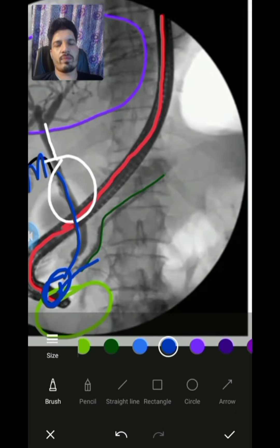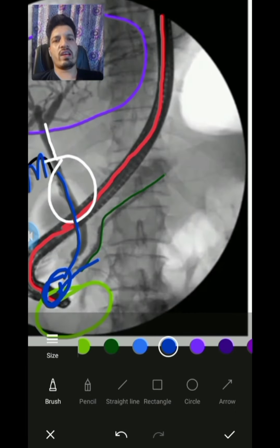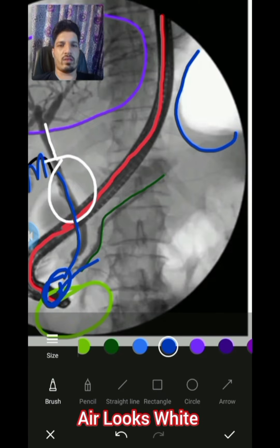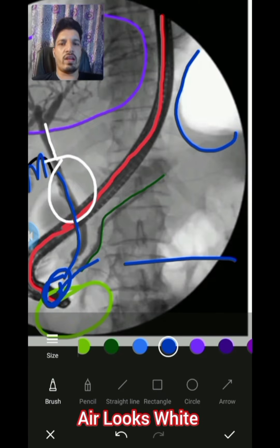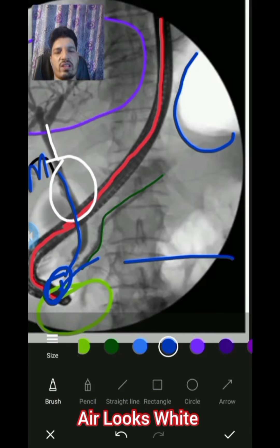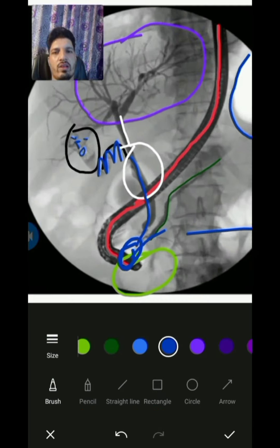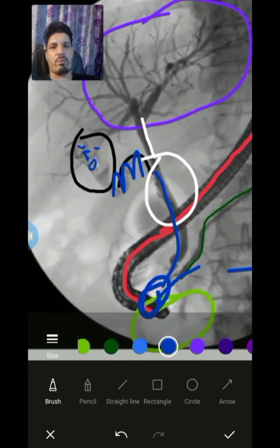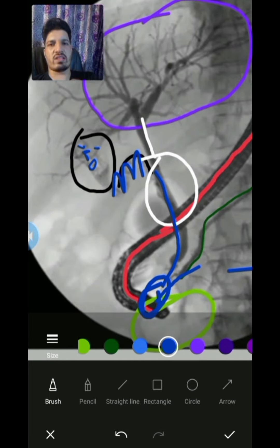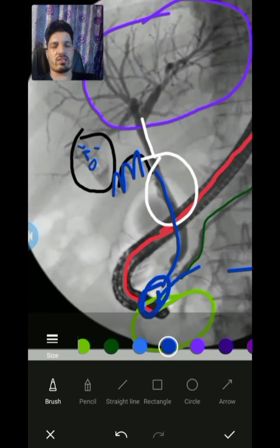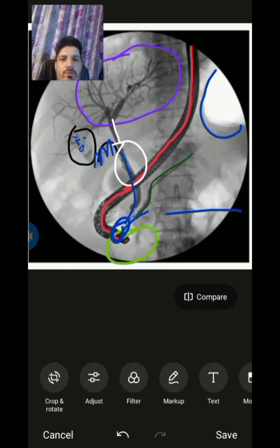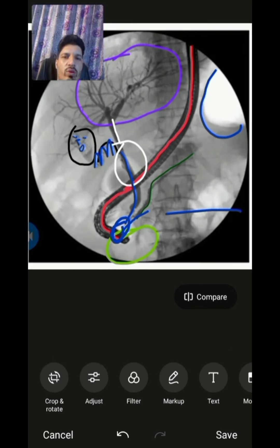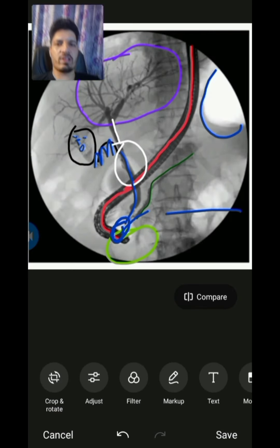At this point I must tell you that air looks white here, and the contrast medium looks black. All the hepatic system you are seeing on the screen is looking black. We have now completed this topic.